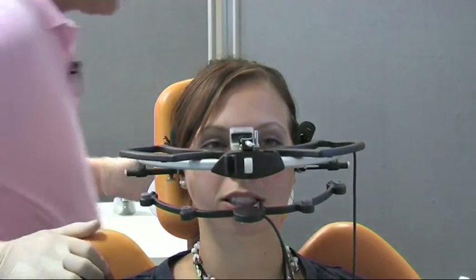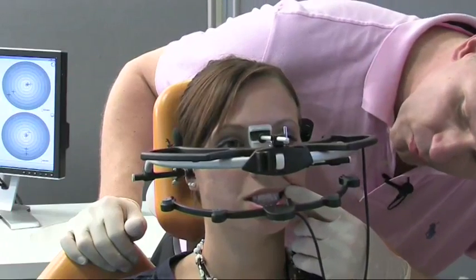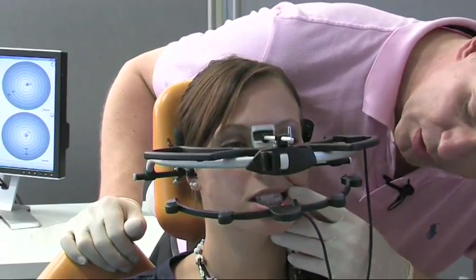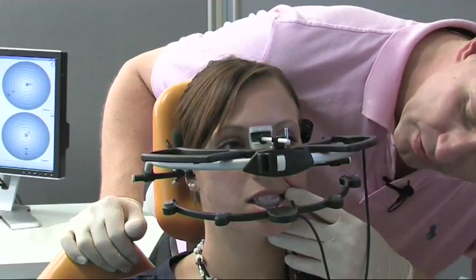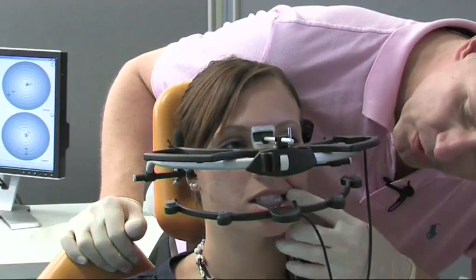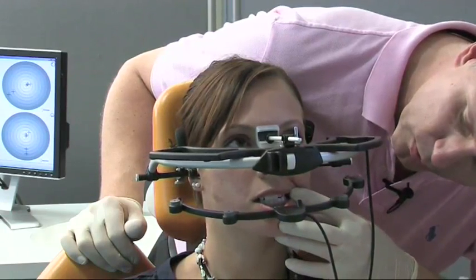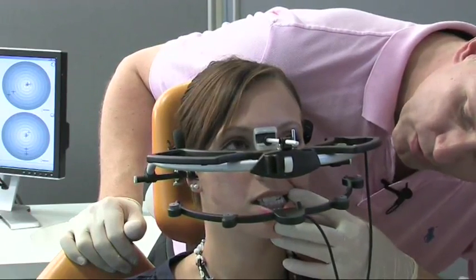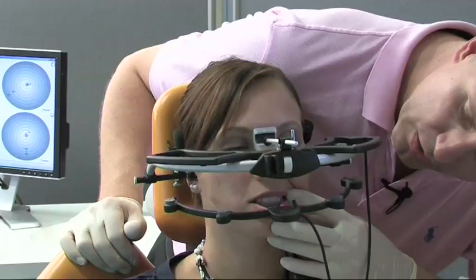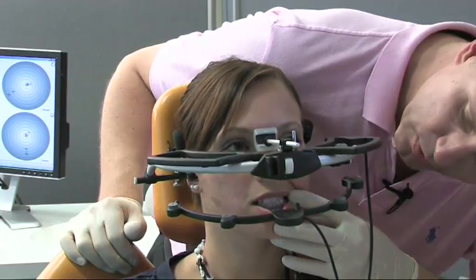Now I must come briefly to the other side. That's good. Further, stop. And to the back. Further. Good. Now to the left and a little over here. Good, but don't protrude, you're cheating. Move slowly over to the middle and the left. Yes, that's good. Further, further, stop. That's fine, remain so.